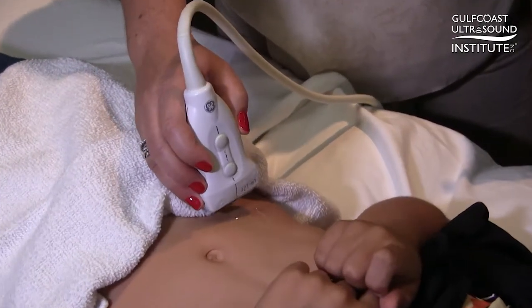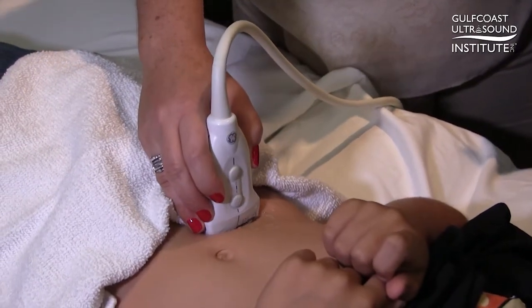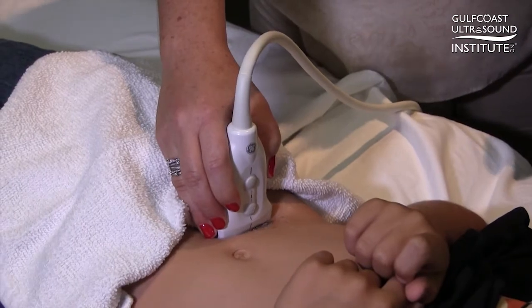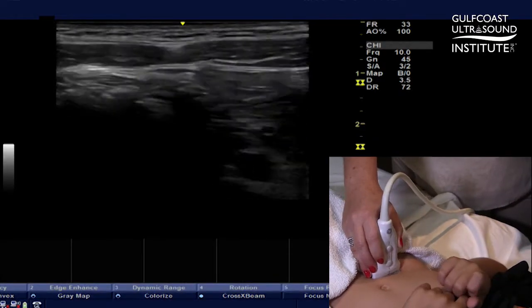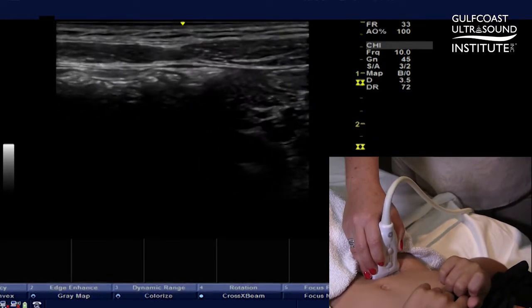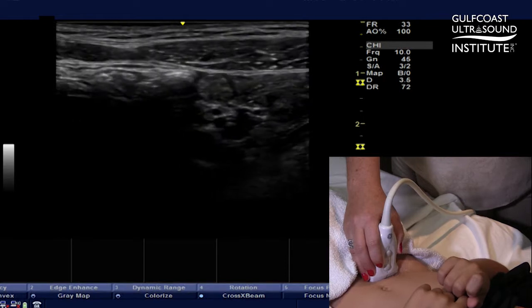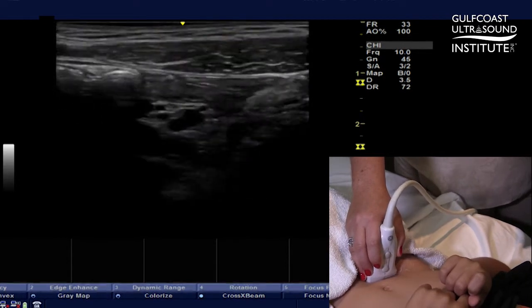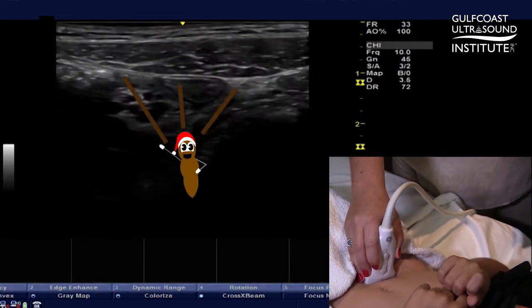I start scanning either where they say it hurts the most or where I think McBurney's point is, and I'm going to try and find the psoas muscle and the iliac vessels. But wait — I don't see the appendix, but I see some poop.